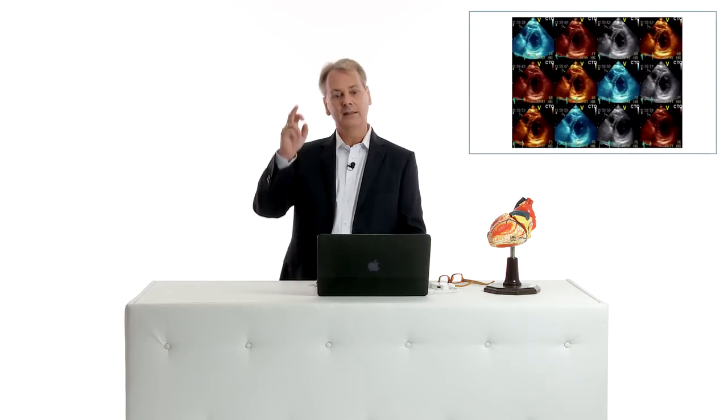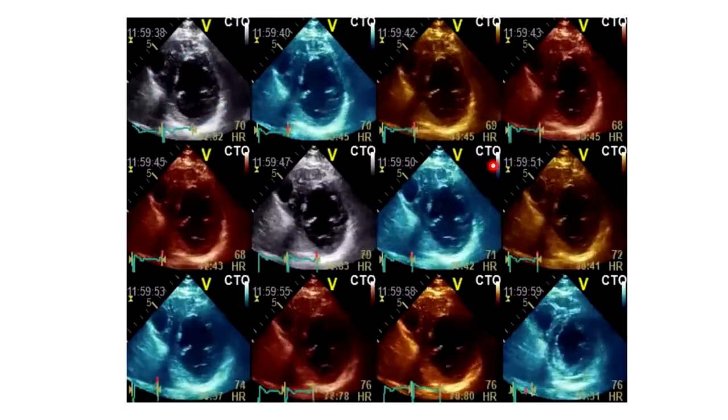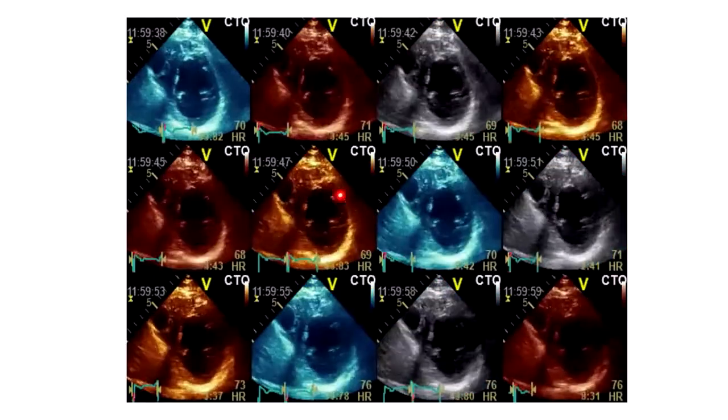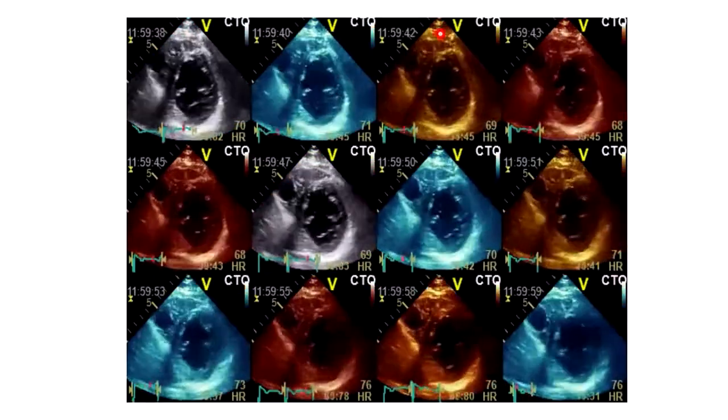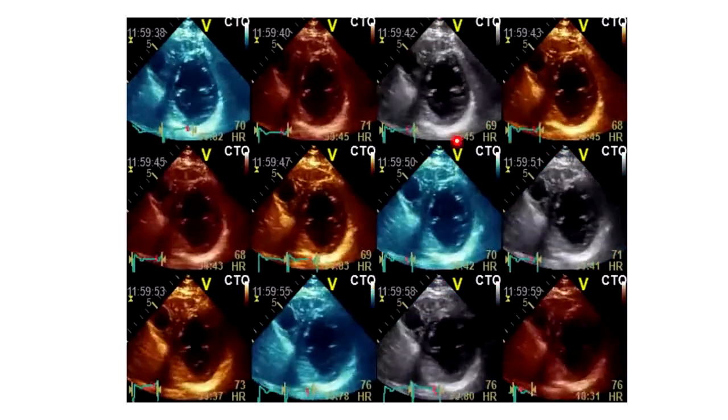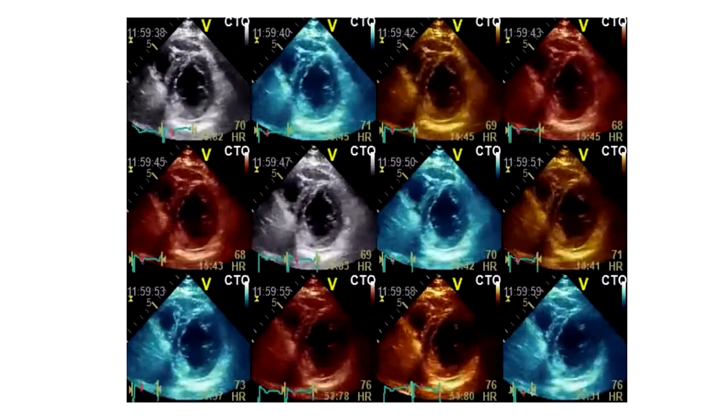If you, however, use a transducer position which is too far caudal, you will also get an oval shape of the ventricle, but in this case, the oval shape will be more in a longitudinal direction. So this is an image that I actually performed for Easter to artificially get Easter eggs with the help of a short axis view that is too far caudal. So here you see the shape of the ventricle looks like an egg, like an Easter egg. If you want to avoid that, which is usually good if you want to measure, you need to move the transducer simply up one intercostal space.